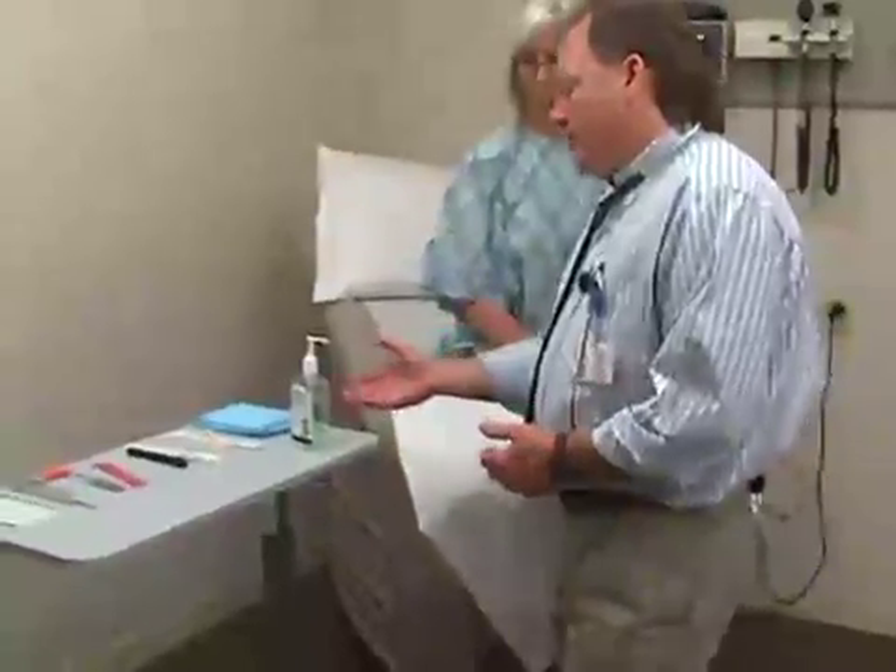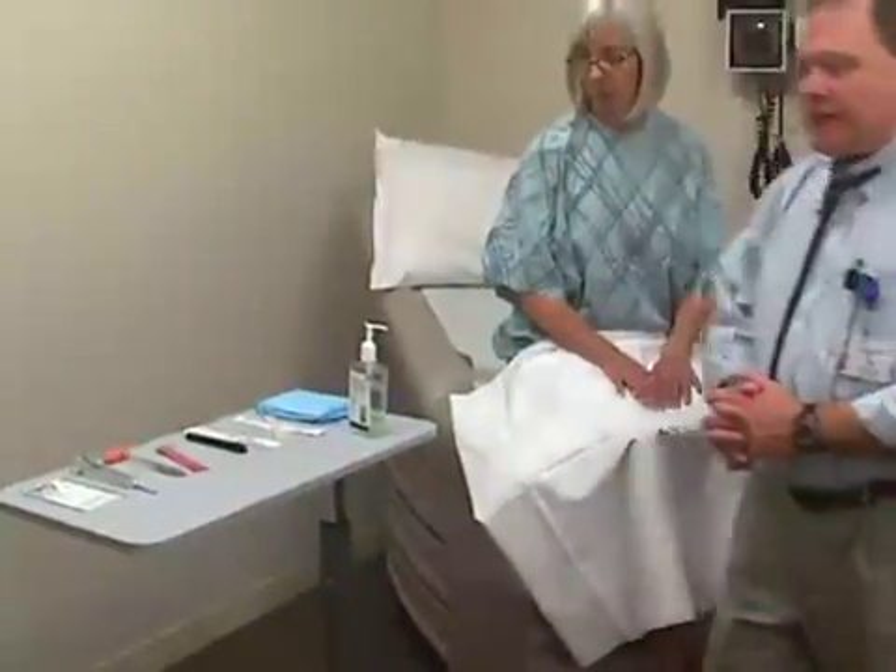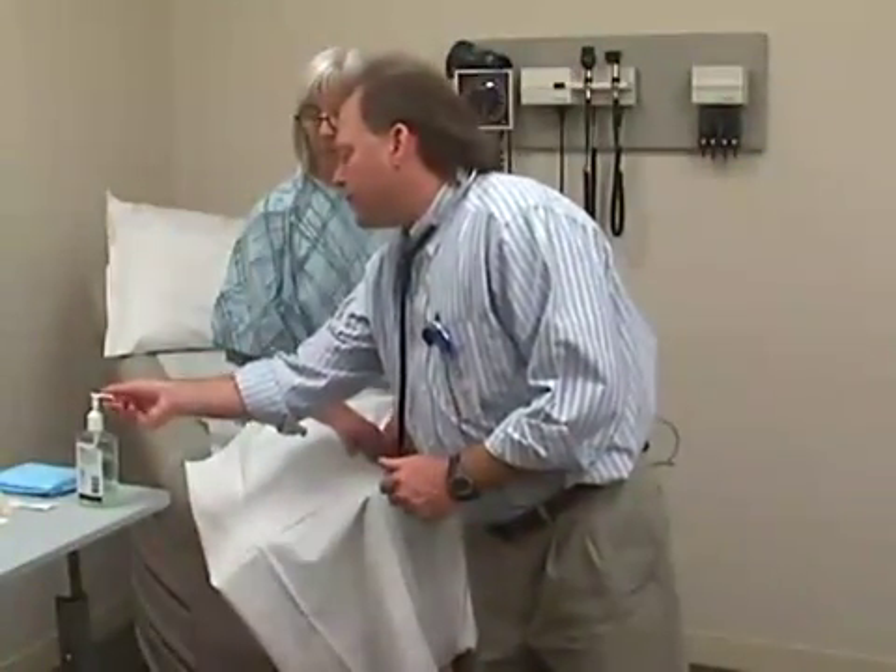Before proceeding, you want to make sure you have all the equipment that you'll need. Here on this table we've laid out all the equipment we're going to need for our physical examination, and here on the wall we have our other tools as well as a stethoscope.